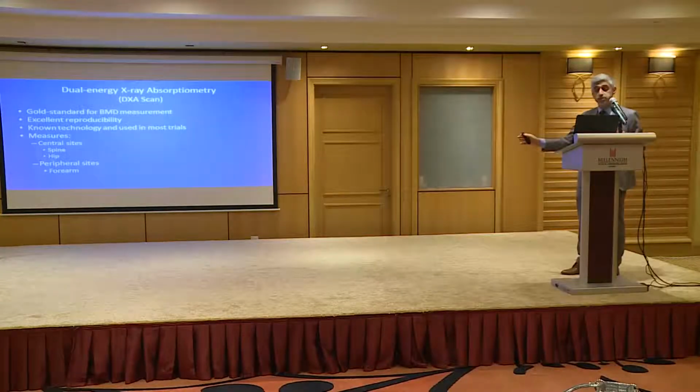When I say gold standard method to measure BMD, I don't mean the gold standard method to diagnose osteoporosis, because the two things are different. To look at BMD itself, the thickness of the bone, the best tool you have so far is the DEXA scan. To diagnose osteoporosis, you also need to interpret the clinical situation and the clinical setting of the patient. So here we're talking about thickness of bone and measuring BMD, not specifically diagnosing osteoporosis. It's a gold standard for BMD measurement.